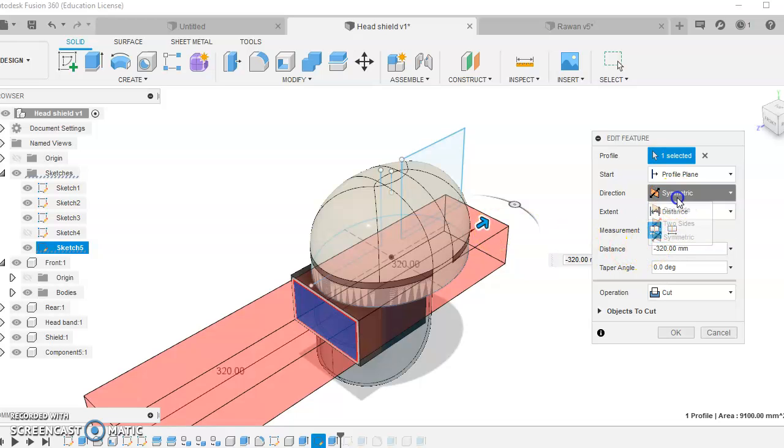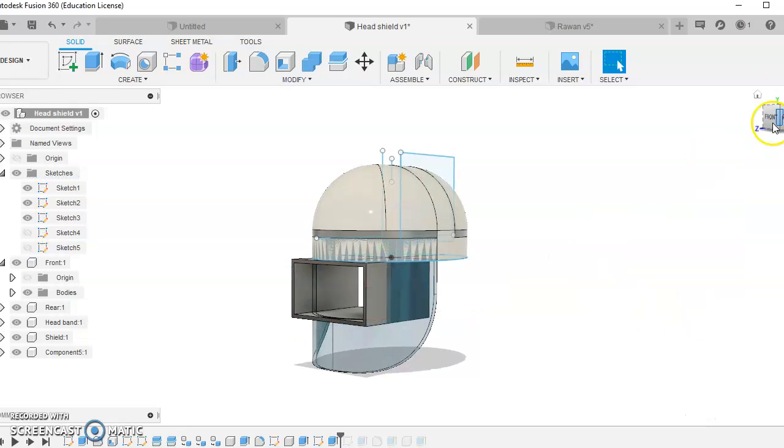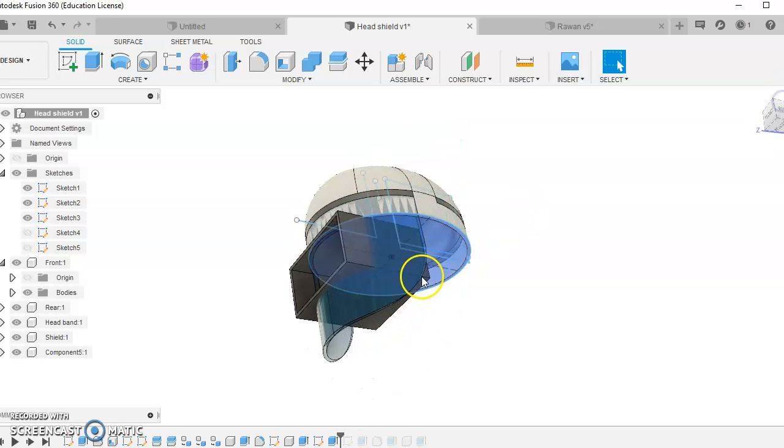Now, because I'm going from the outside edge, I could go one side. I've gone symmetrical, and I'm using the cut function, and that pink colouring just shows you visually which part is being removed. So I'd click OK with that, and now you can see it's cut a hole through the centre. Now you know as well as I do, I need to get rid of that shape, so I delete that.